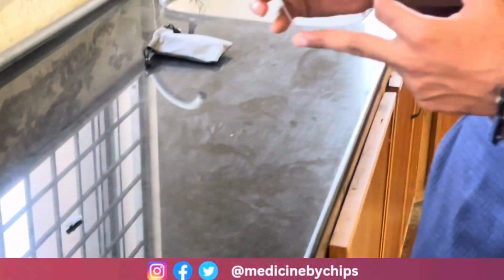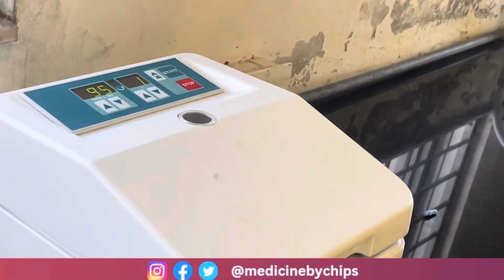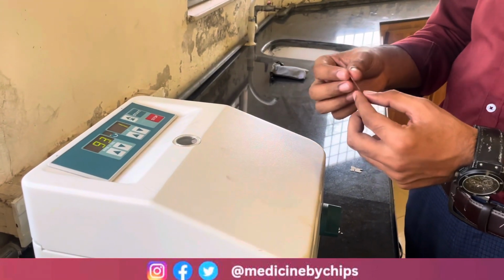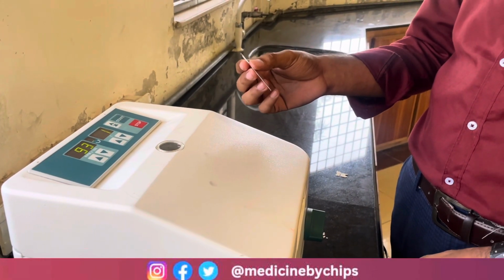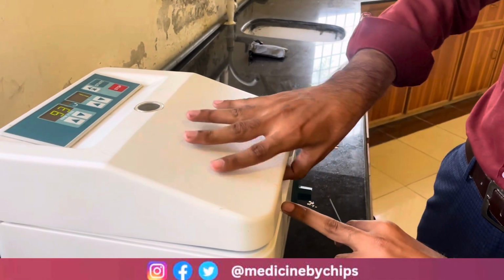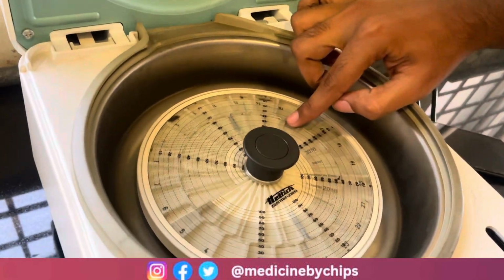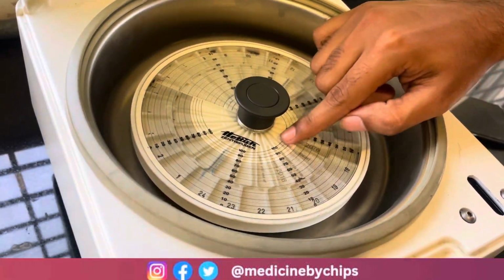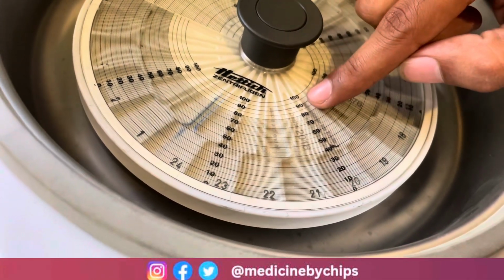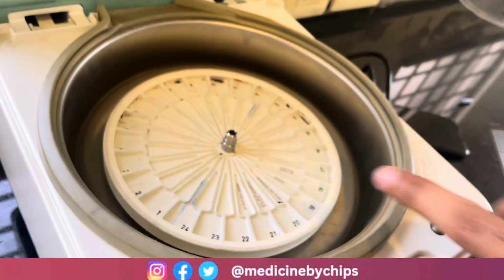Now the capillary tube has been sealed, and we will put it into the centrifuge machine. This is the centrifuge machine, and we will centrifuge the capillary tube so that we can examine the hematocrit of the blood. First of all, we will open it like this. This is known as the plate or microhematocrit reader. You can see these are the markings so that we can note the hematocrit value of the blood.